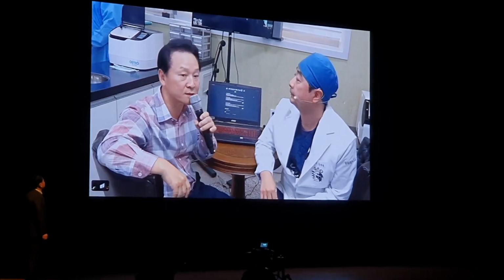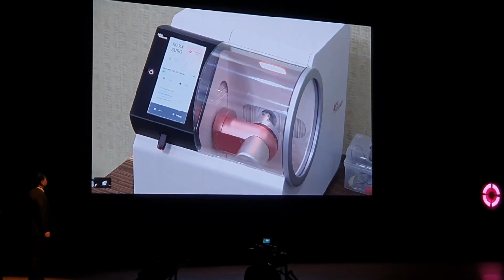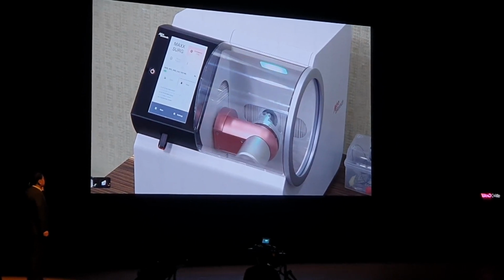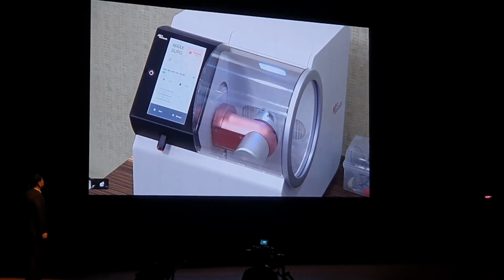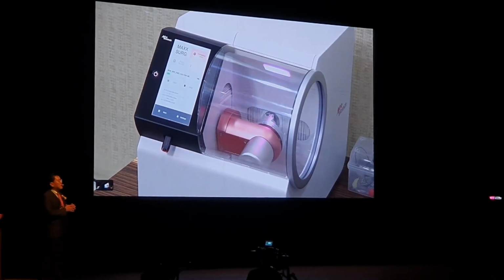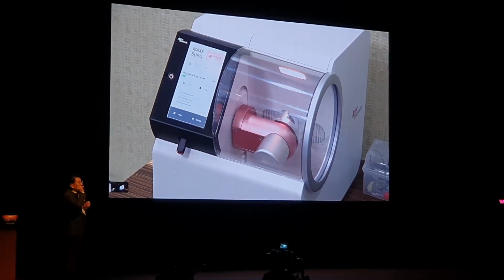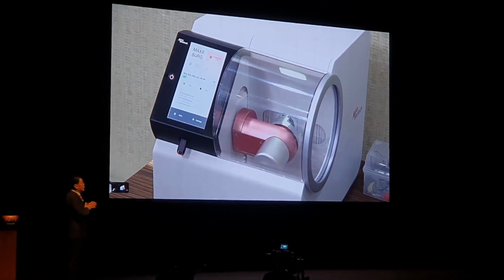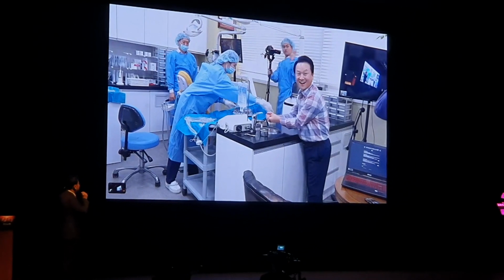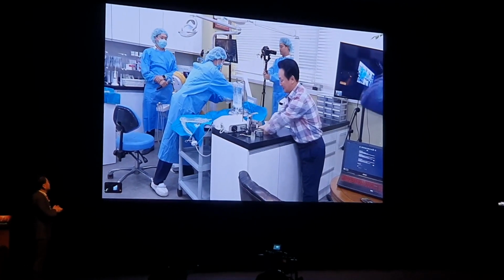Let's do this. Alright, so the operating surgeon has changed. So let's begin preparing for the surgery. So I'll go ahead and put on the sterile gown. Wow. Isn't this the beauty of live surgery? Unexpected changes. So self-implant placement using the VARO guide from Dr. Ho by Dr. Ho. Let's do this. Now he's washing his hands.